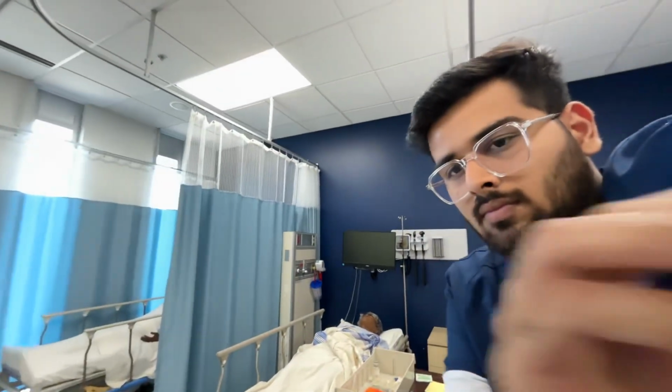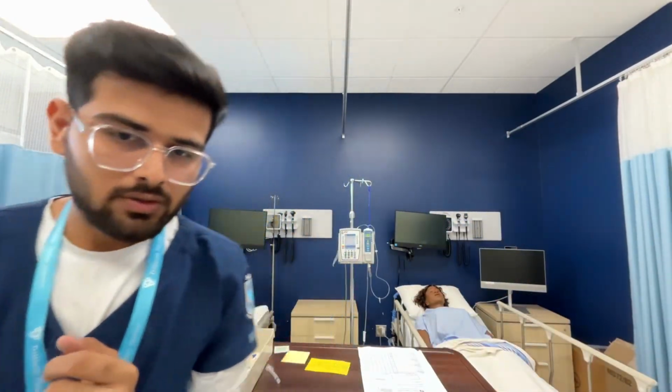360. And I'm going to set it up. Yep. Here you go.